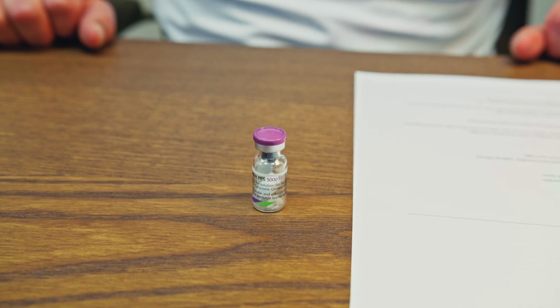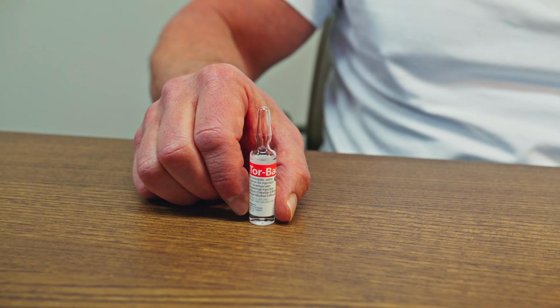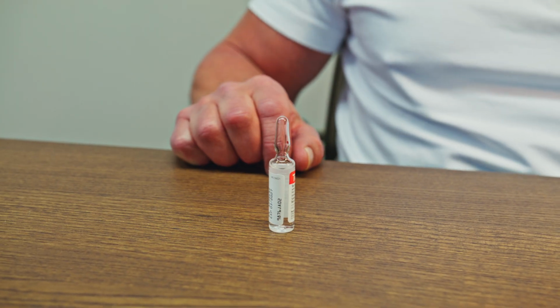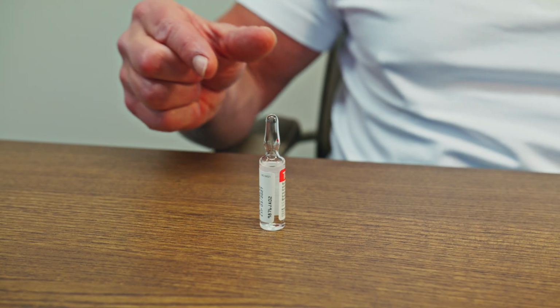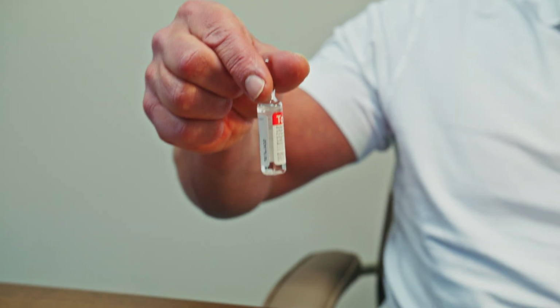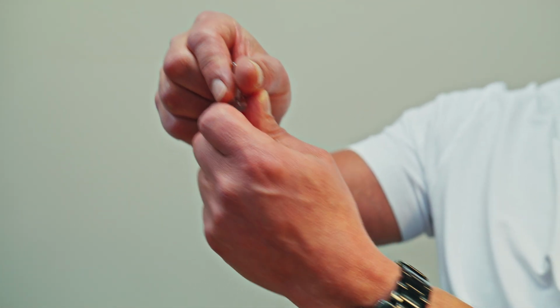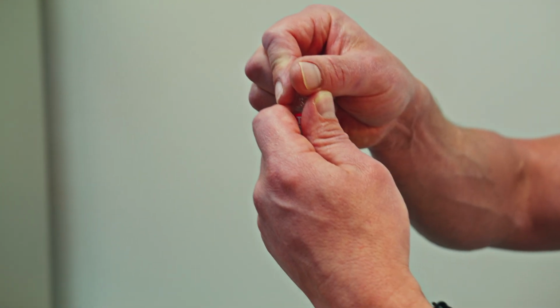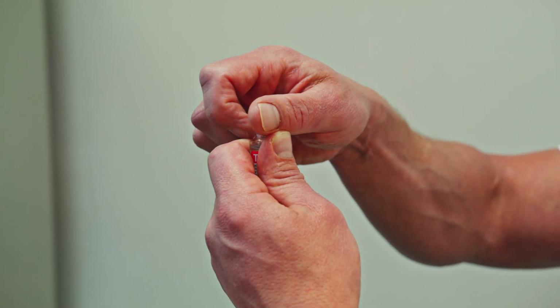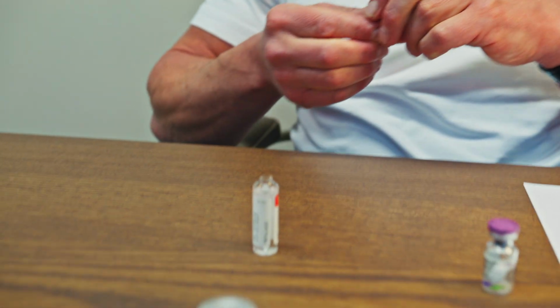The next thing we're going to do is draw up the saline. So we're going to snap open one Torbac ampule of bacteriostatic saline. It has a dot. I'm right-handed, so I pick up the top with my right hand, my thumb goes over the dot. I hold the body of the ampule with my left hand. You can see that my thumbs are at a right angle. I'm going to turn my knuckle in and I'm going to lever, snap. I'm going to discard the sharp.